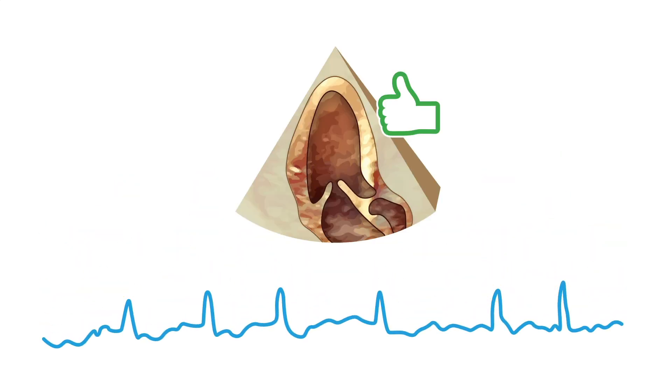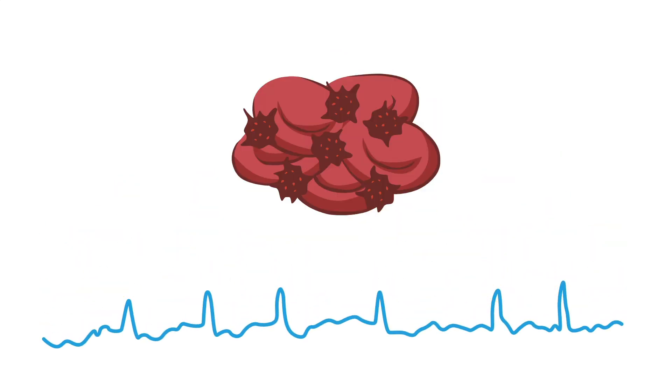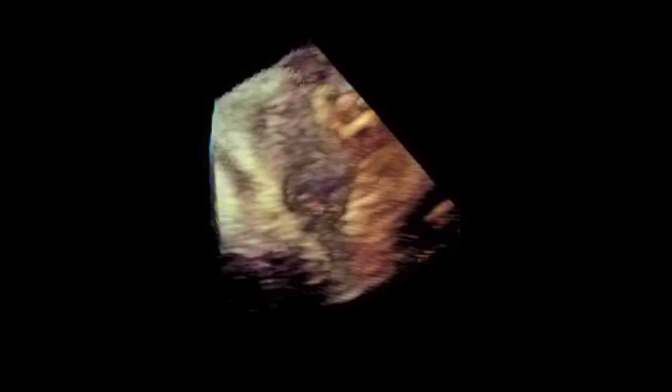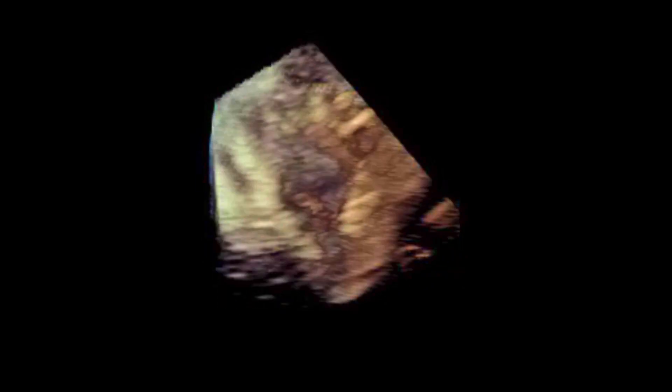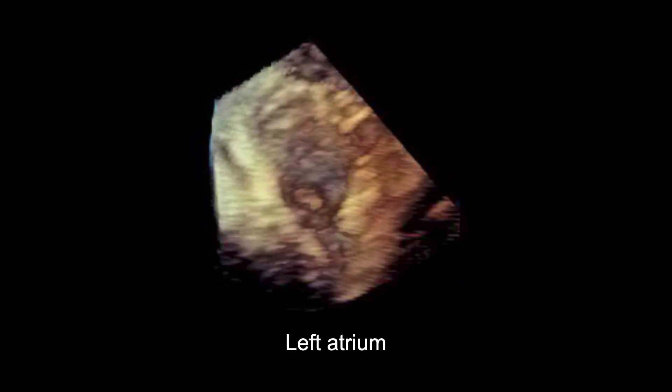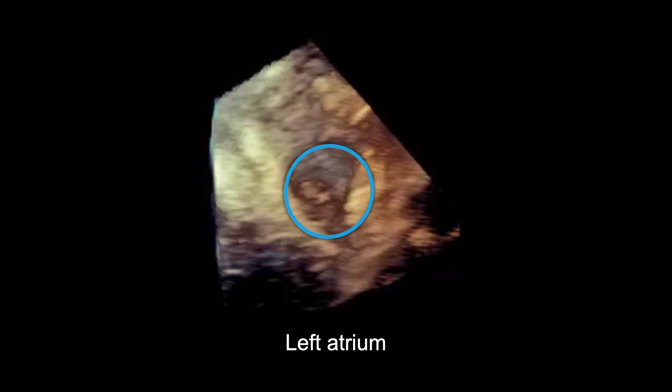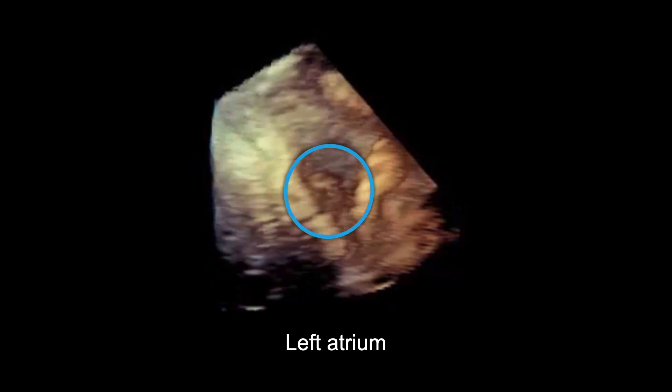Also keep in mind that thrombi are a common complication of atrial fibrillation. Here is a transesophageal 3D echo volume rendering of the left atrium showing a large thrombus in proximity to the left atrial appendage orifice.